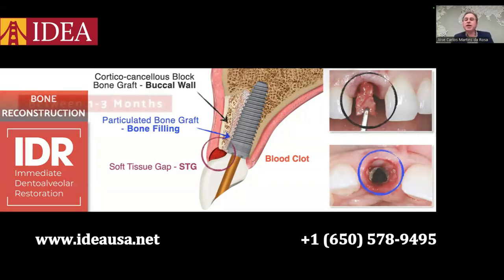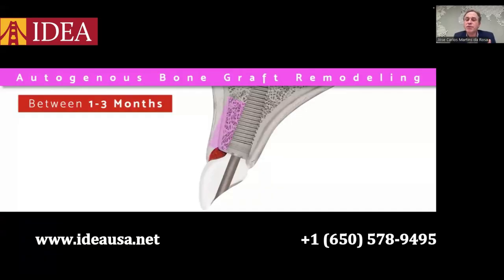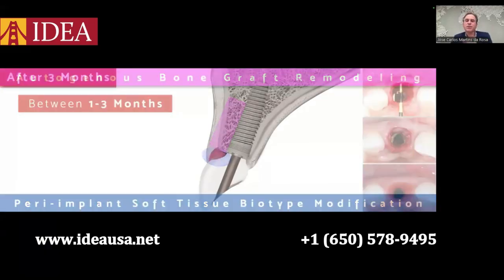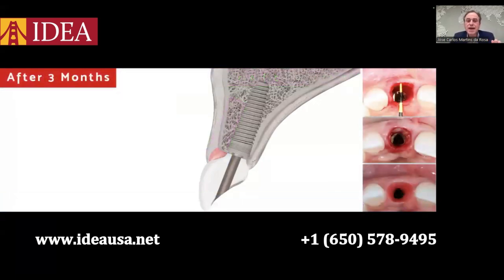So between 1 and 3 months, what are we expecting? First of all, the autogenous bone graft remodeling process, and also the peri-implant soft tissue biotype modification. So this is our dream after 3 months: to have bone completely remodeled and still stable, and improvement in soft tissue thickness.